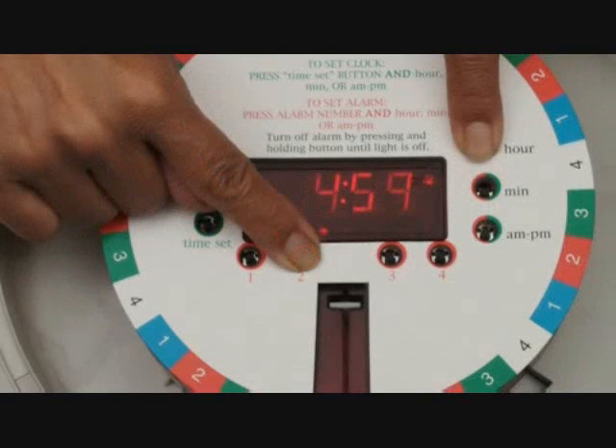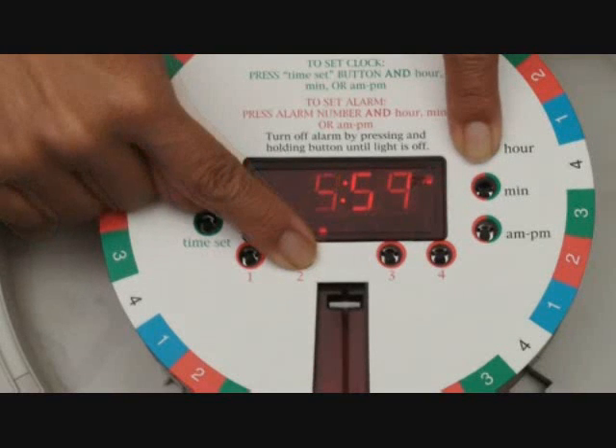To set the alarms, hold the appropriate alarm button down and press the hour, minute, and AM/PM buttons.